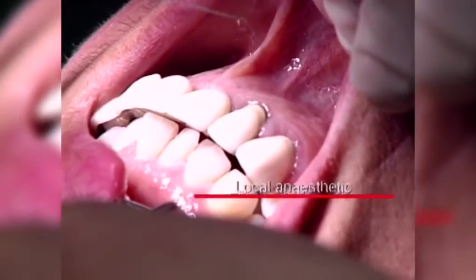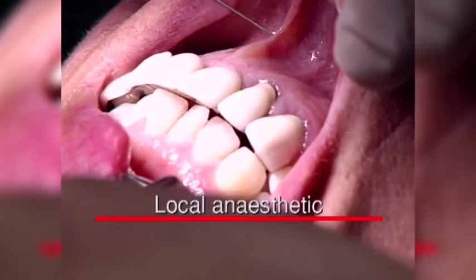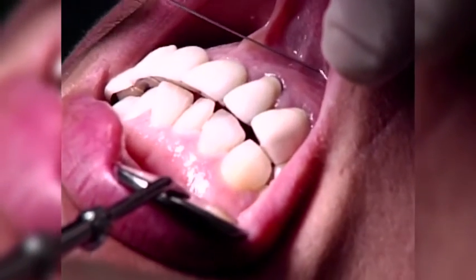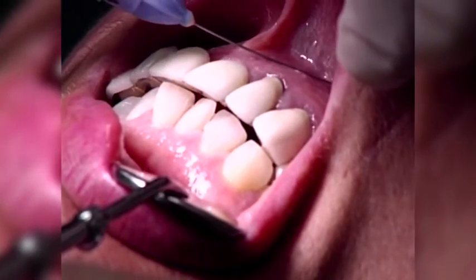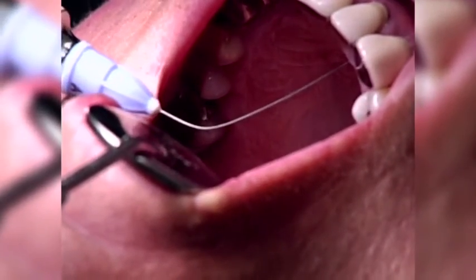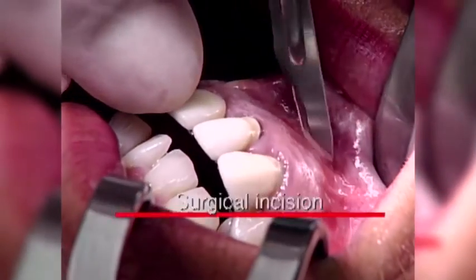A local anesthetic is administered. Wherever possible, a vasoconstrictor should be used to obtain a clear working field and adequate analgesia — that is 1 to 80,000 adrenaline. In our example, a buccal infiltration is used.